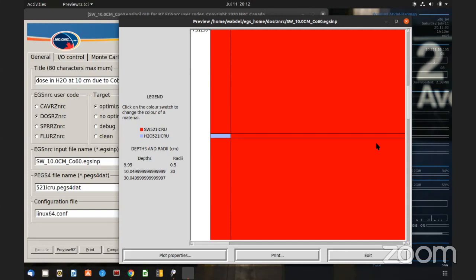My issue is when you start to say, okay, the equivalent depth in solid water is 9.6. What do you mean by equivalent depth? Equivalent depth to me is basically a depth where, if you did a measurement there, it will give you the same dose as if you actually measured in water at 10 centimeters. So to be consistent, I'm going to put water and water here. That's what I'm trying to do.